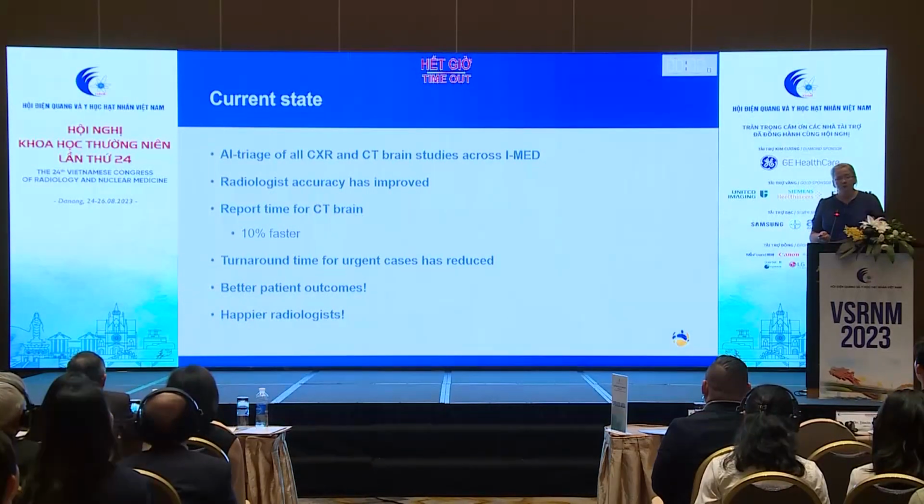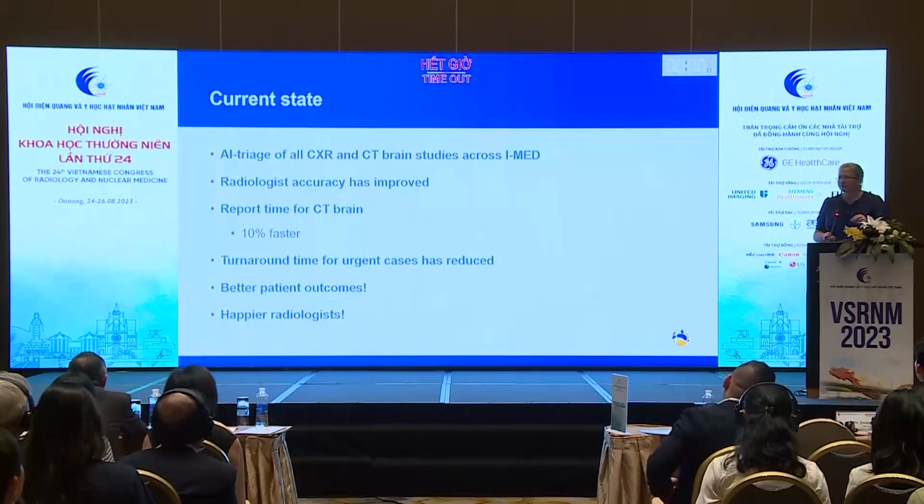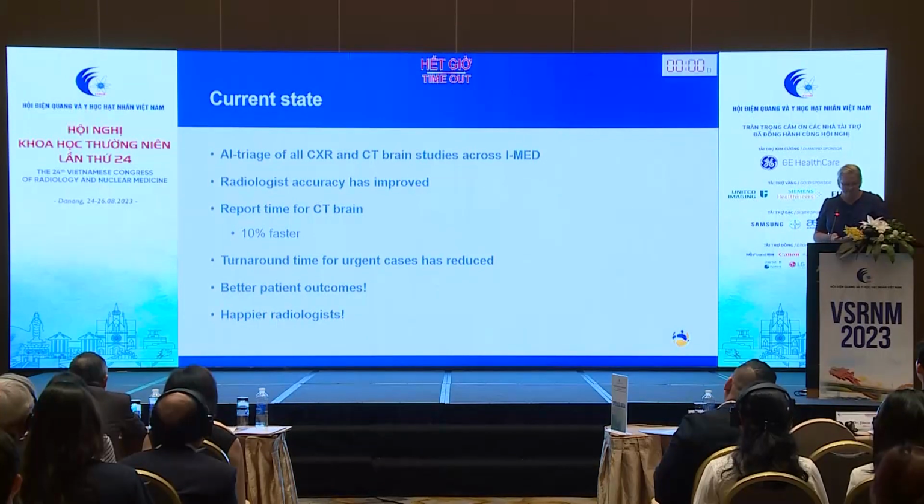I always say to people, when everything is written urgent on the referral, then nothing is urgent, because you don't know where the real pathology is. We use the AI to tell us which cases are urgent.